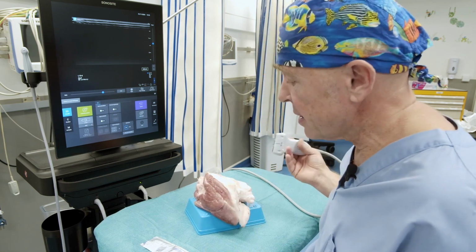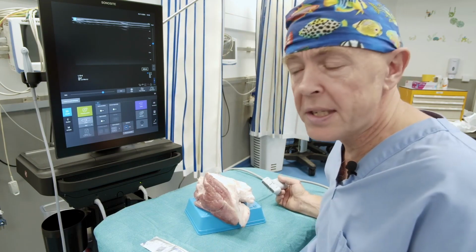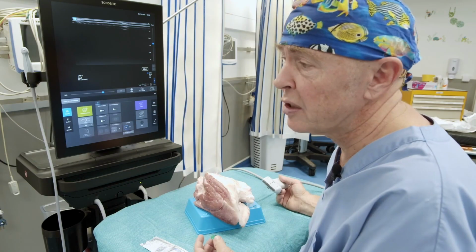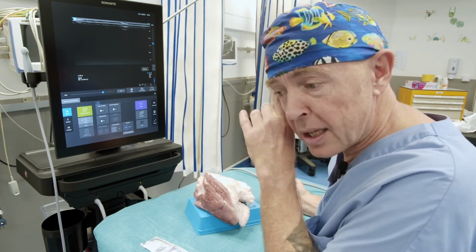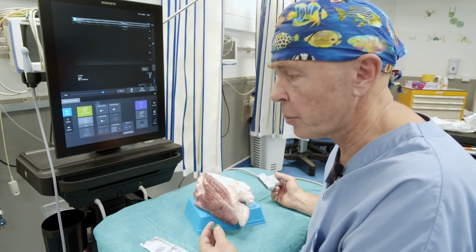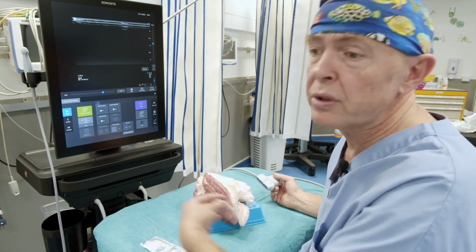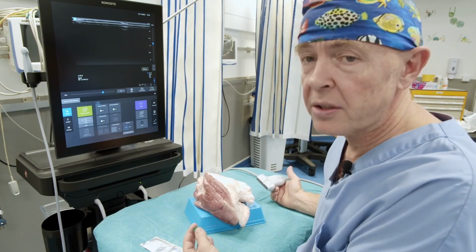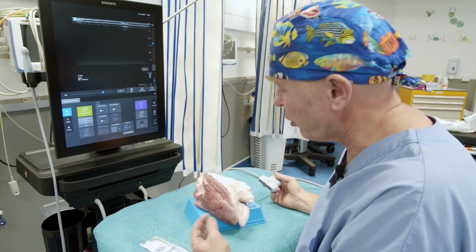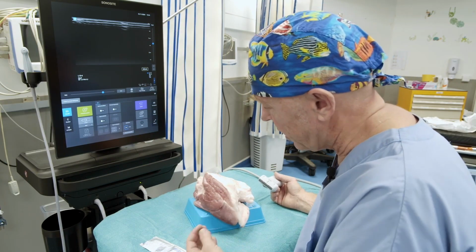Certainly, one of the relatively straightforward methods to conduct this particular workshop is by utilizing simulation phantoms, which are quite expensive in the marketplace and are accessible through specific partners. These phantoms have the minor drawback of leaving imprints in the gelatin blocks. Alternatively, although I am not particularly fond of wastage, you can, on occasion, especially if you are conducting a demonstration or training session for approximately 10 individuals, opt for a piece of meat. It should be the most affordable option available, yet it should still contain some meat and ideally some fascia and a bone as well.